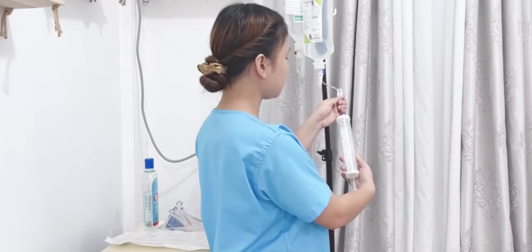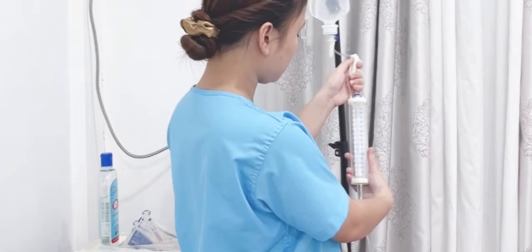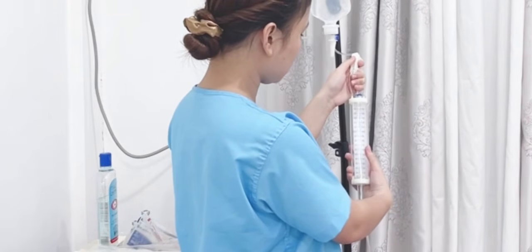Then open the upper roller clamp. Then you have to run the tubing and put it on a volumetric set up to 50 ml.